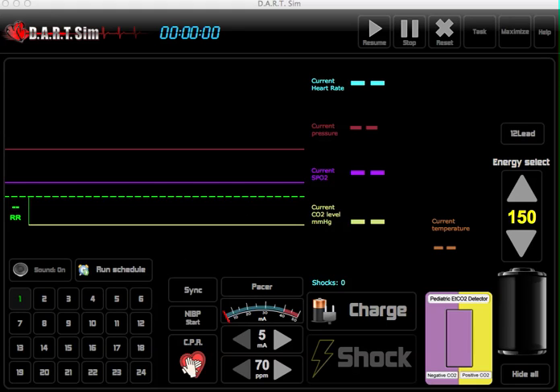Hello and welcome to DART Sim. Today I'm going to briefly discuss how to operate the ECG Rhythm and Defibrillator Simulator.